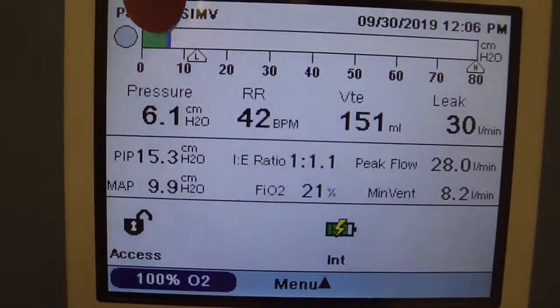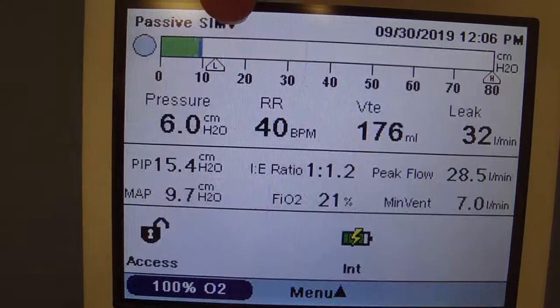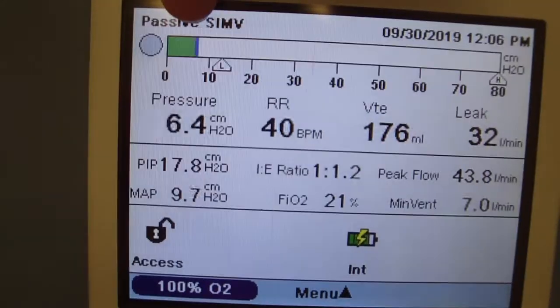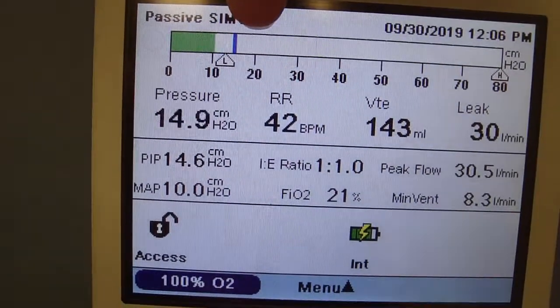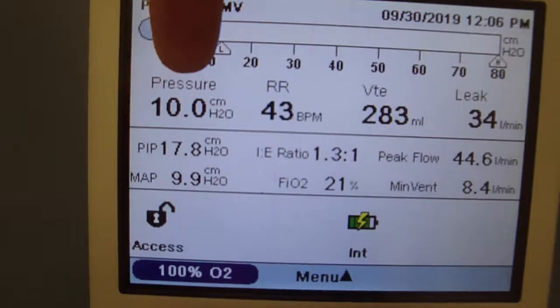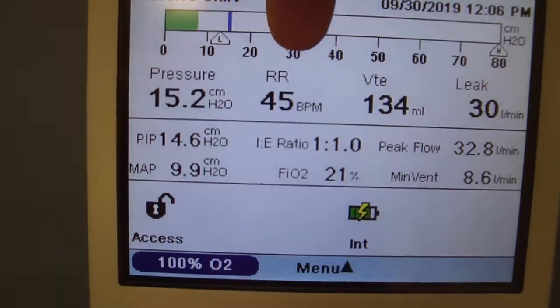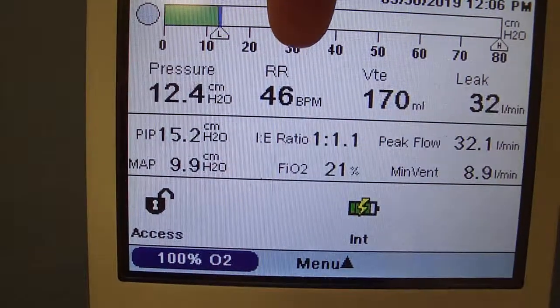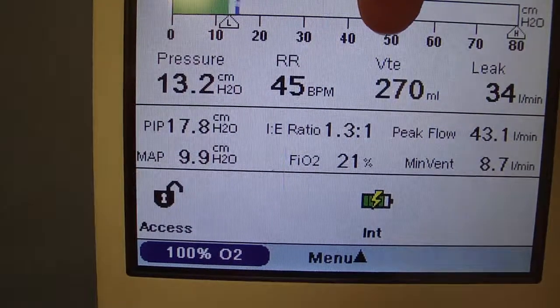This bar at the top shows each time of breath, returns to PEEP, and then the peak inspiratory pressure. The pressure is also shown here. The respiratory rate is managed, and then the tidal volume.